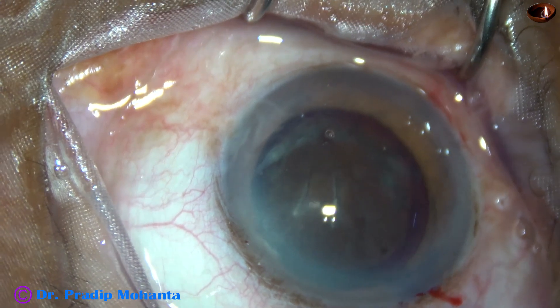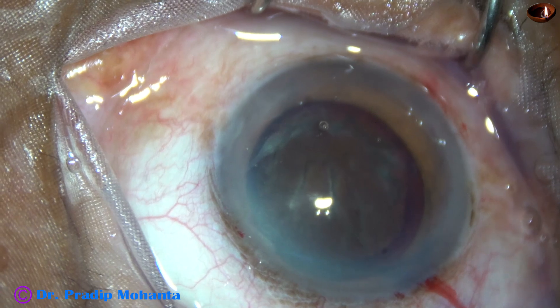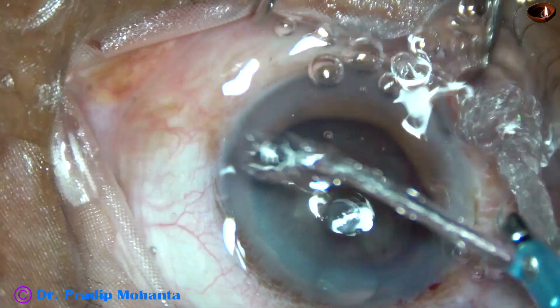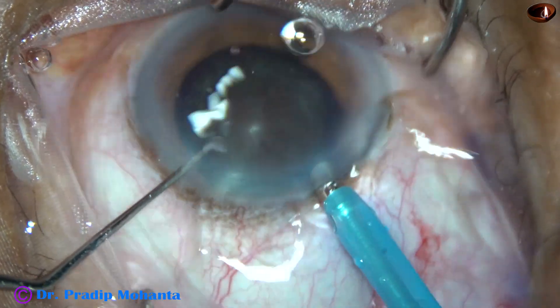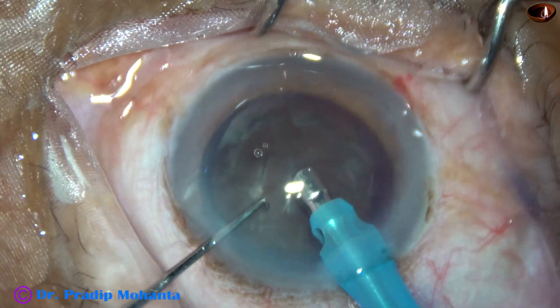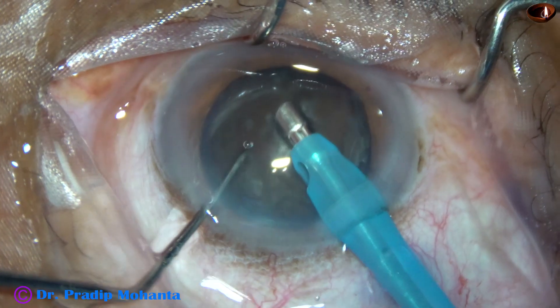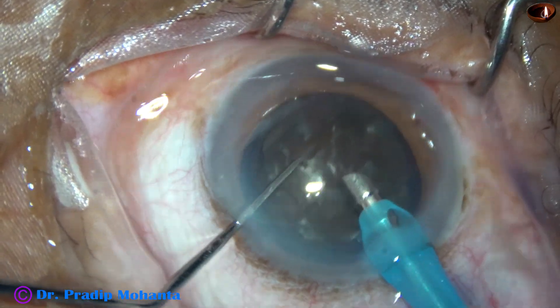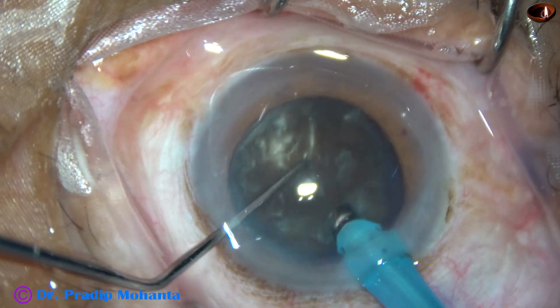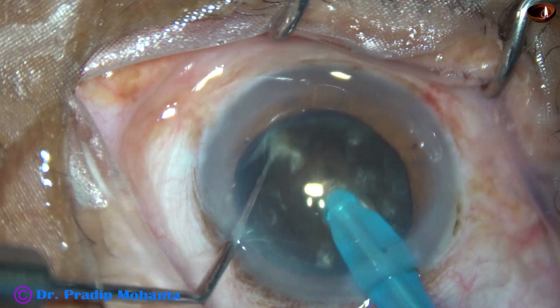And now nucleus management — the most difficult part in this case. I exposed the teeth of the phaco needle a little more, about 2 mm. The phaco needle is introduced bevel down. Some superficial cortical lens matter is removed. Now watch my technique: the submarine approach for this kind of very hard cataract, where you can manage the case without making any groove and without sculpting.